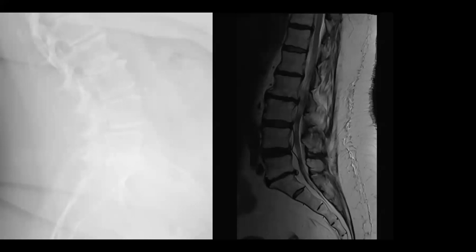Yeah. Just want to explain for the audience, ReActivate is a stimulator, but it's not a neurostimulator, it's a stimulator for the muscles. It's placed at L3, only L3, and the bilateral electrodes are stimulating the muscles like a TENS, but it's not transdermal, it's implanted. And the patients do their exercise, I think, twice a day for 15 minutes, isn't it? Usually 25 to 30 minutes twice a day, but people will vary that regime. That's the standard advice. Some people activate 3 times a day, some people do once a day.